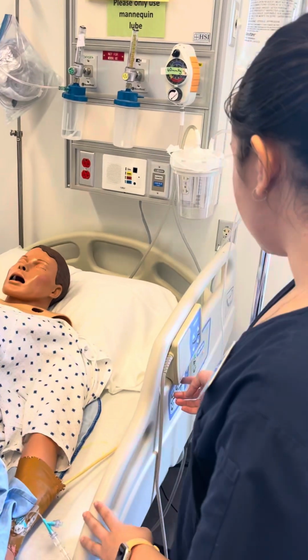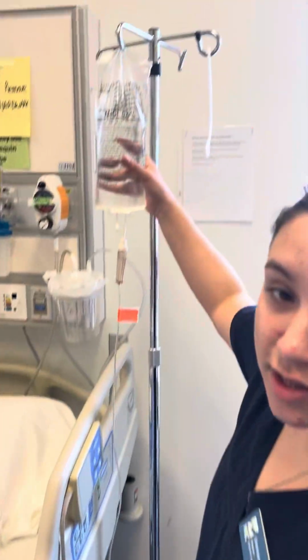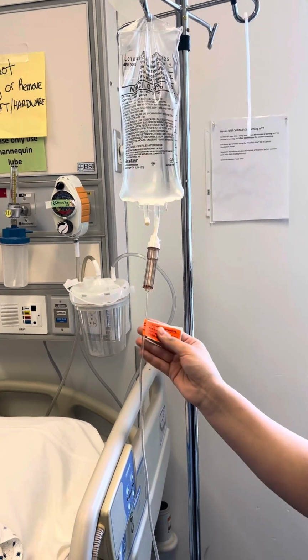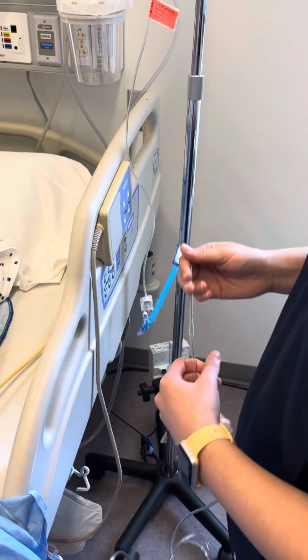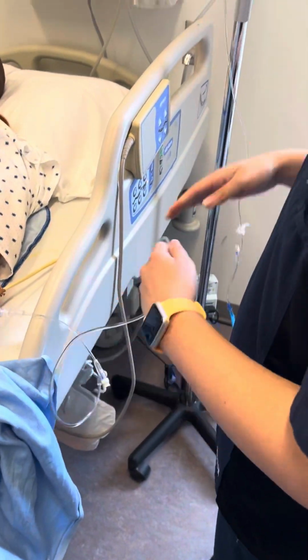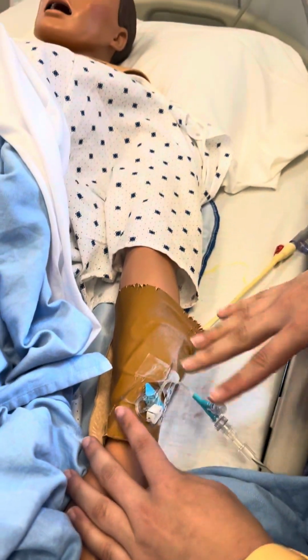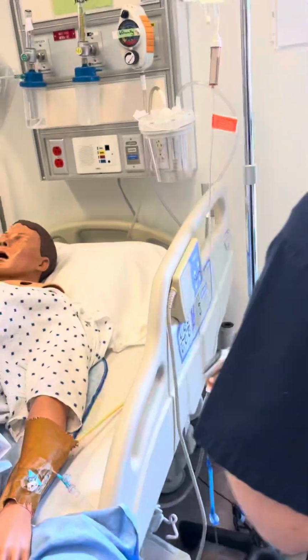So raise the bed. First thing I'm gonna do is check their primary line. Normal saline, yep, that's correct. I'm gonna check for kinks, air bubbles, check the label here, that's good. Everything looks okay. I'm gonna go the whole way down. Okay, and I'm gonna check the IV site, everything looks good, no redness, no bleeding, no signs of infection, nothing like that. So next I'm gonna alcohol swab.